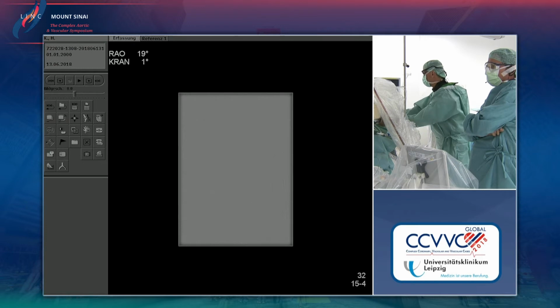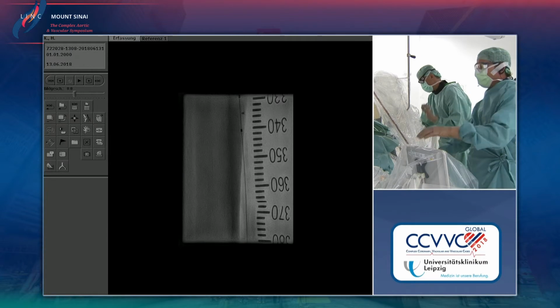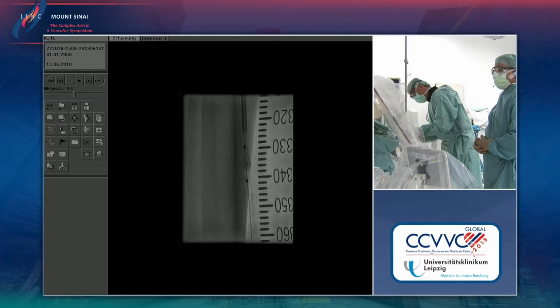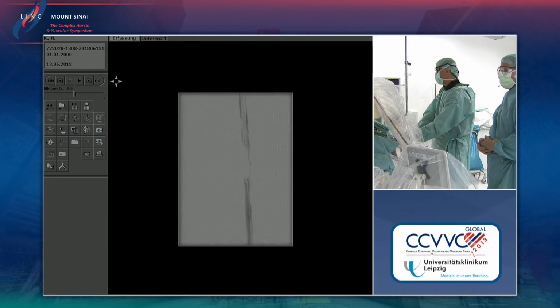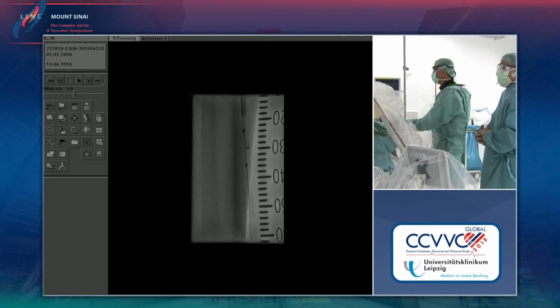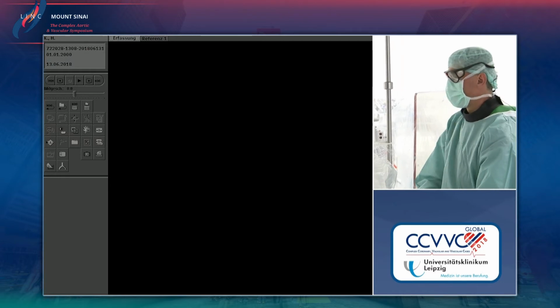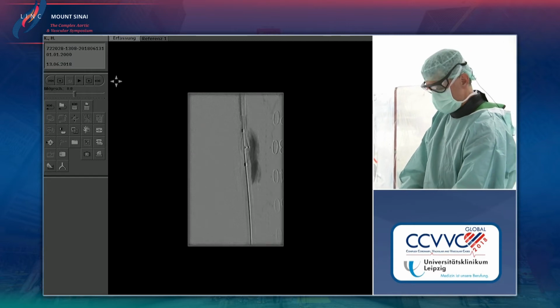So here again. No, I was just going to ask, we were discussing at the beginning of the case whether an initial IVUS run would have been helpful because there were some question marks about size, question marks about subintimal, question marks about where the dissections are. Now it's going to be a little bit harder, I think, to visualize. So the last 2 ones were not effective. I think here in this area I have more calcium. Effective again. It's very spooky.